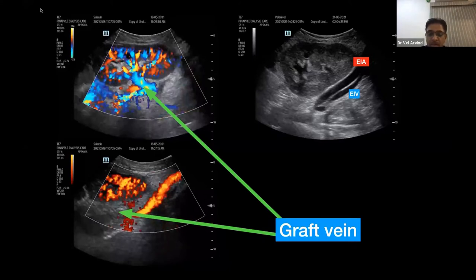The other way you can do it is to put a pulse oximeter or something which makes the pulse volume audible to your ears. As the pulse comes, you have two kinds of correlation, the audibility and the visual cue: once the sound comes, the pulse wave will go up. That's where you can find it. If you put only the color Doppler, aliasing effect will be there, some kind of turbulence. So you first look with power Doppler, then go with color Doppler. This is the basic idea.